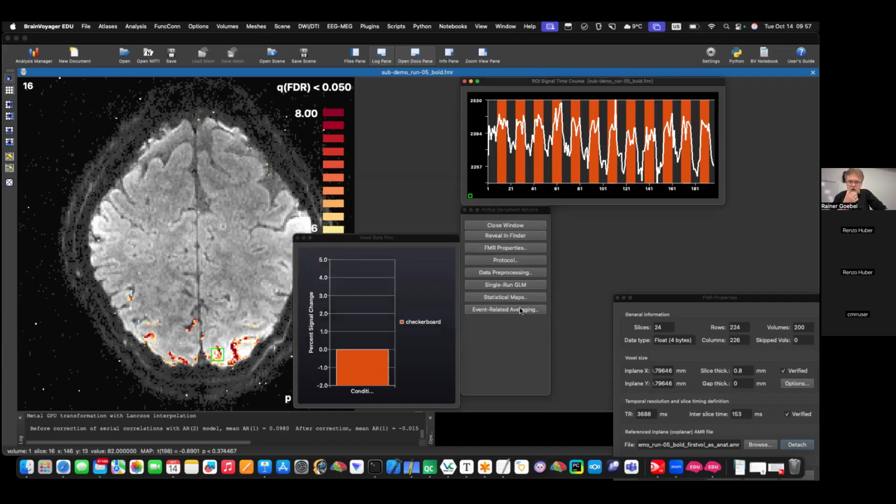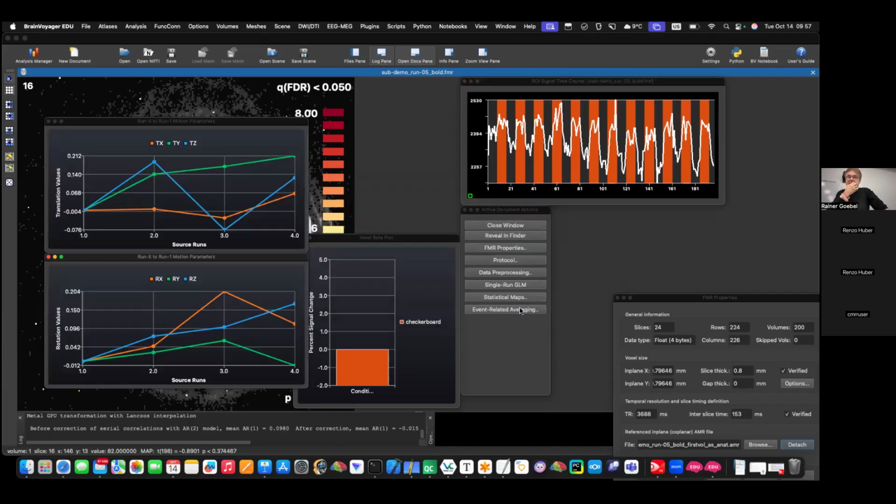So if I now say go with these 4 runs, that's what we get. And now because it has more scale, you will see that the changes are actually very small. You should not be alarmed. Oh, there's a lot of motion between run 4, 3, 4, 5, 6. It's just that I adjust the scale to show the difference, right? And you see, for example, the values go from 0.004 to 0.2, which is very tiny. Relatively tiny. Before it was much larger, it was several millimeters.